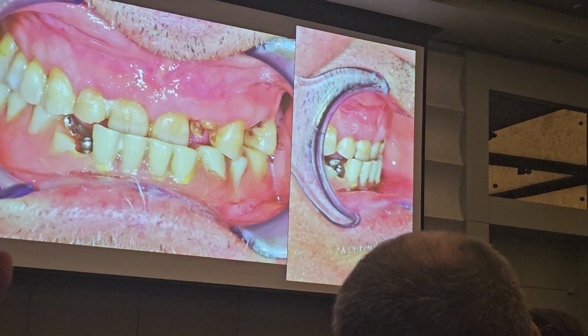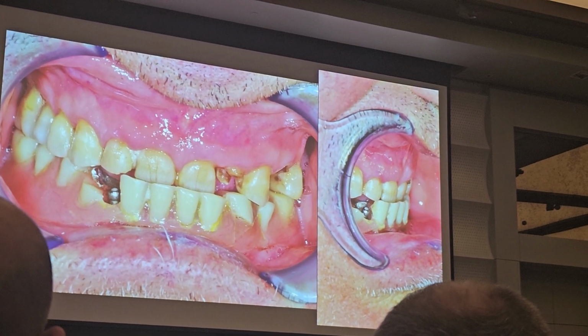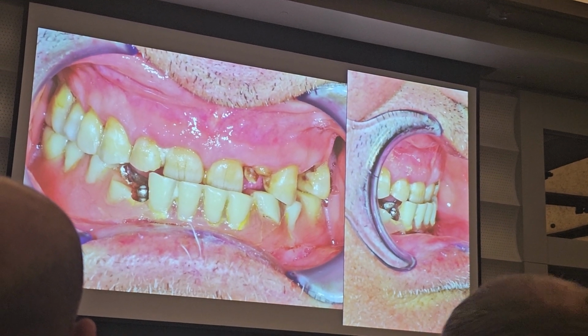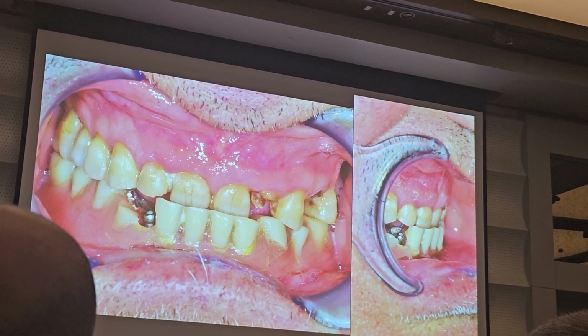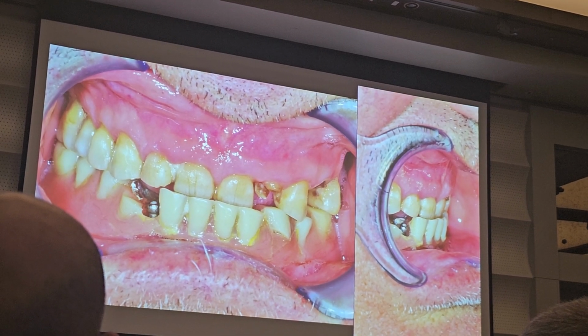You know what happens? In large cases, we have no extrusion for compensation. That's why when you wear the mandible, it does one rotation, and the patient goes into class 3. Okay? This is one of the problems we have in full arch cases with acrylic. When the wear is a lot, teeth can extrude, but not implants. So the patient goes forward.